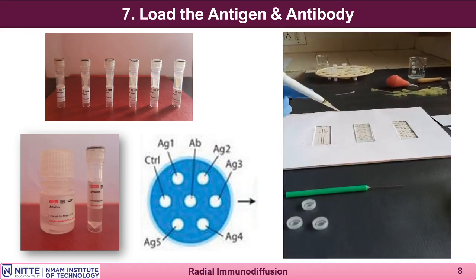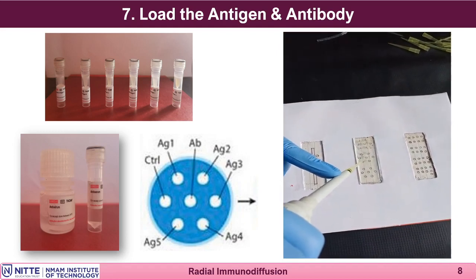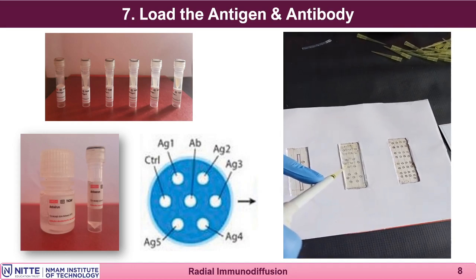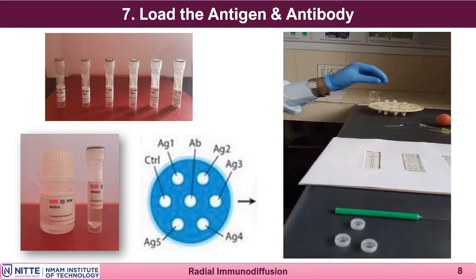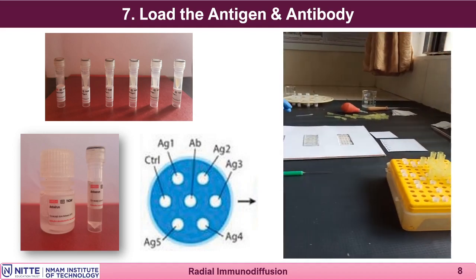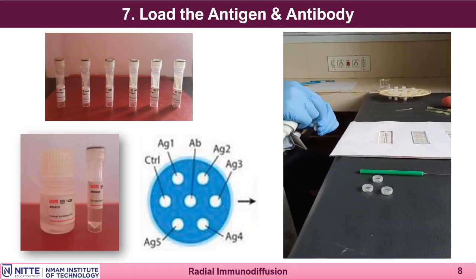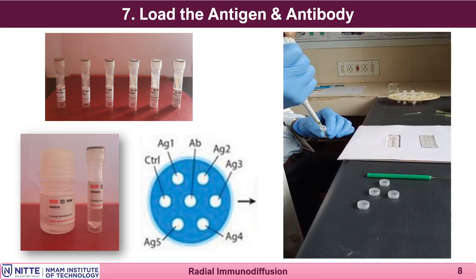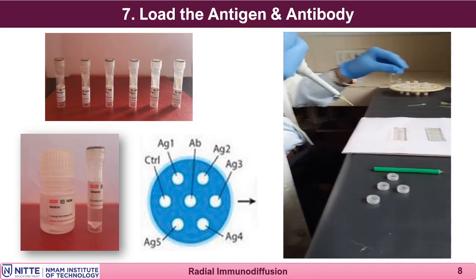If you do not support the tip with your left hand, once again you see it clearly, there is a possibility that when you are touching the corner of the well, due to a little bit of shaking of your right hand, the well may tear and that well becomes useless. Therefore, please see to it that whenever you are preparing the agarose slides, the torn wells should not be used for testing, because that will give wrong results.